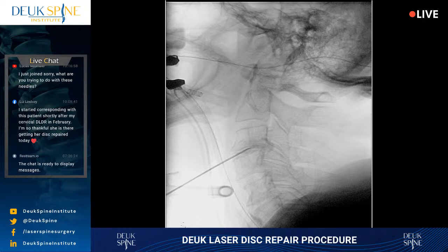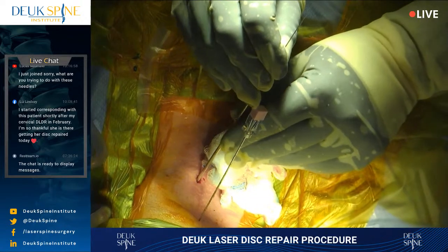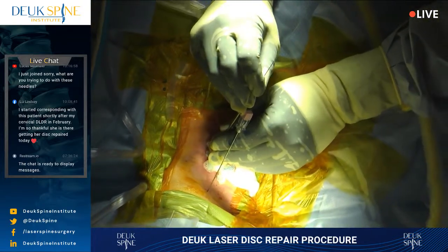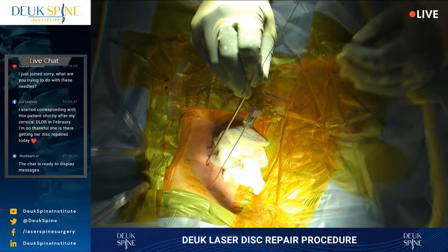You agree? Because I have to use the X-ray to navigate, Sean, I think that's, no, it's not much worse, believe it or not. Actually, I could see the disc space now, whereas before I couldn't. So I'm just going to have to be happy with this, okay? Because I'm using the X-ray to navigate, I want to make sure it's showing me reliable information. So I need to make sure I calibrate it, so to speak, with the spine and make sure it's lined up properly.